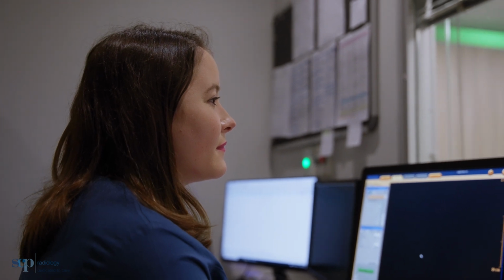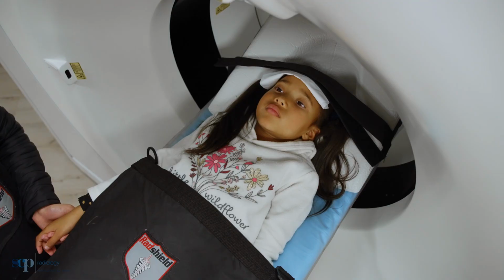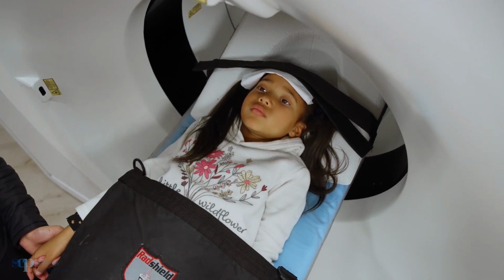When a radiologist looks at a CT brain of a child who has had head trauma, we definitely want to exclude any injury to the brain. This can include brain edema, so generalized swelling of the entire brain, but it can also be a hemorrhage within the brain parenchyma. We also want to make sure that there's no hemorrhage on the surface of the brain, since this can cause a lot of pressure on the brain and can have severe consequences.